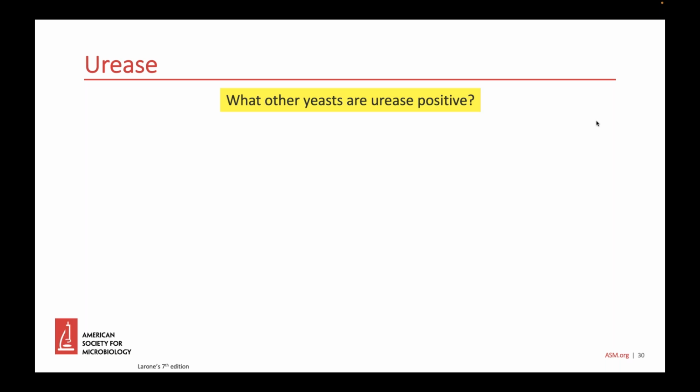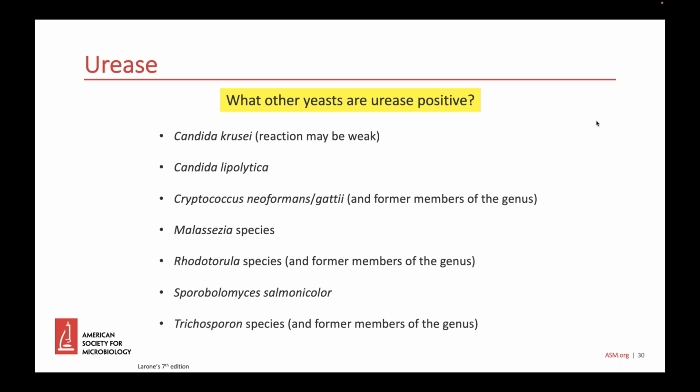Okay, well, this is my list. Hopefully it's inclusive. Krusei, reaction may be weak. Lipolytica, Cryptococcus neoformans, gattii, Malassezia species, Rhodotorula, Sporobolomyces salmonicolor, and Trichosporon species.